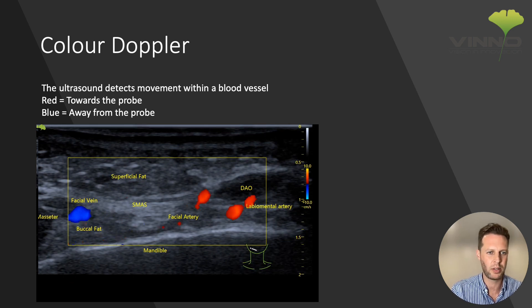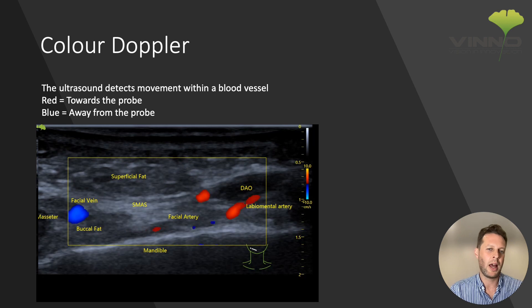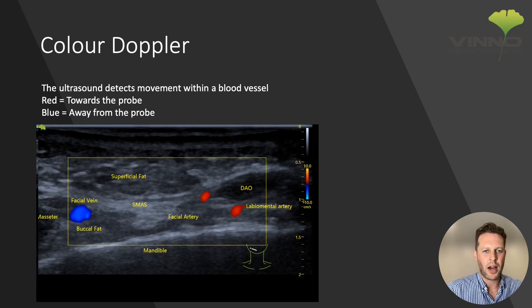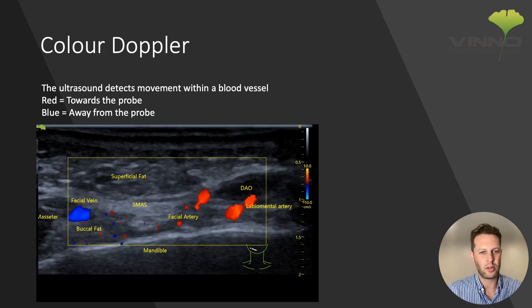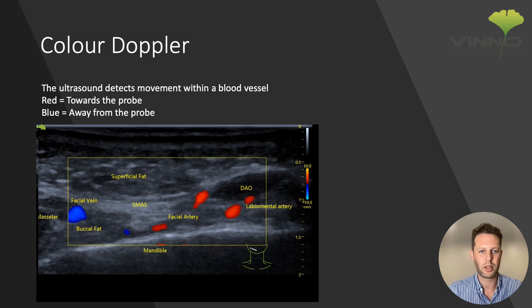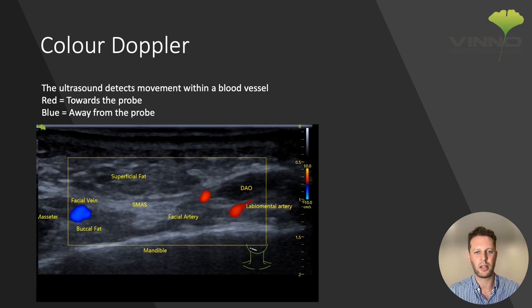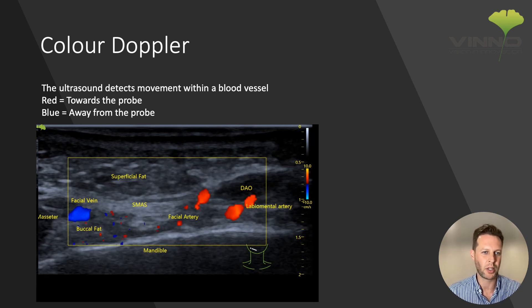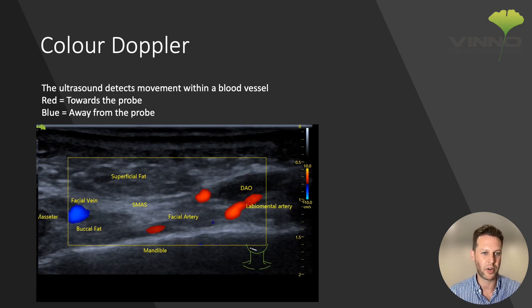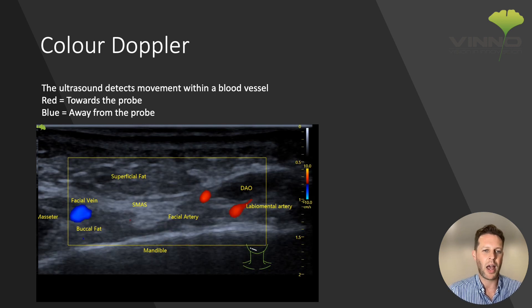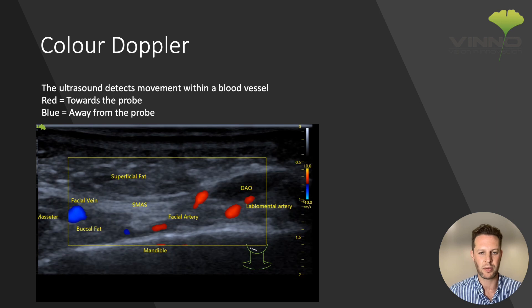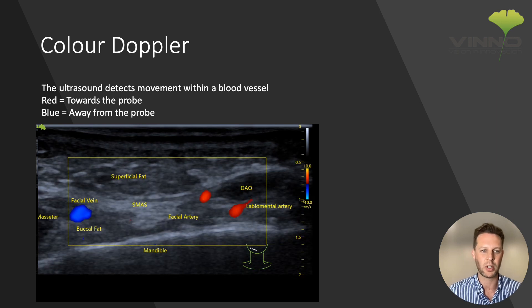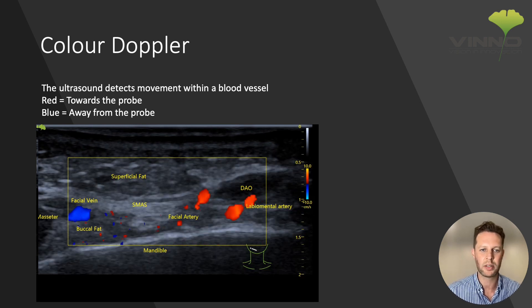A better way to differentiate artery from vein is to look at the pulsatility of the vessel. You can see here that the labiomental and the facial artery are pulsing away, whereas the facial vein is not. If you put a bit of pressure on with your probe you can collapse the veins far more easily than you can collapse the arteries.